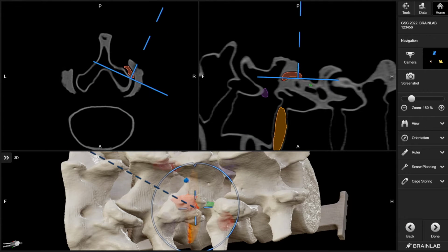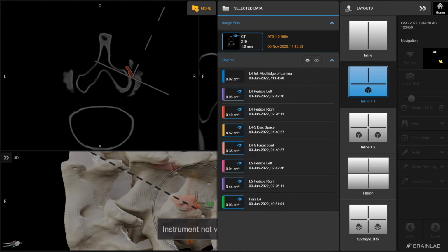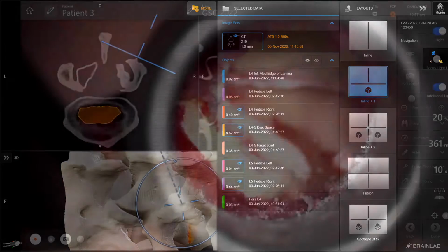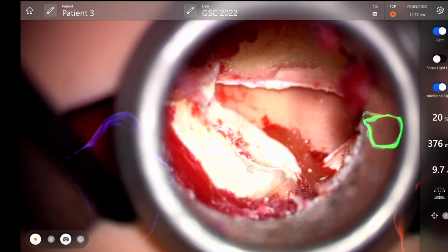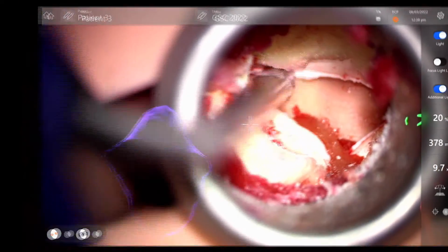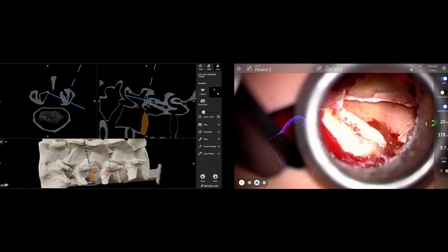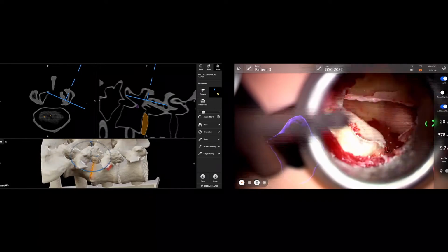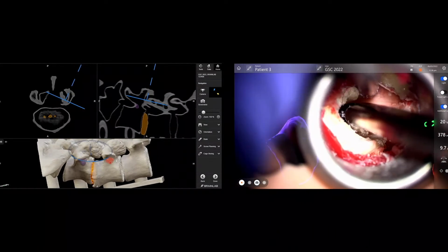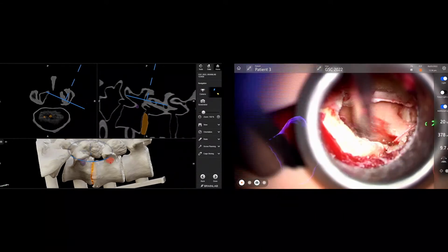Andy, if you open this up again, sorry. So we want to go a little caudal, tighten it. So now let's show me the L5 pedicle. So I can see that there in that weird color. And then I use a 3mm Kerrison to remove part of the lateral recess that's still there to really get down to the actual pedicle. And then I still have the superior articulating process there.